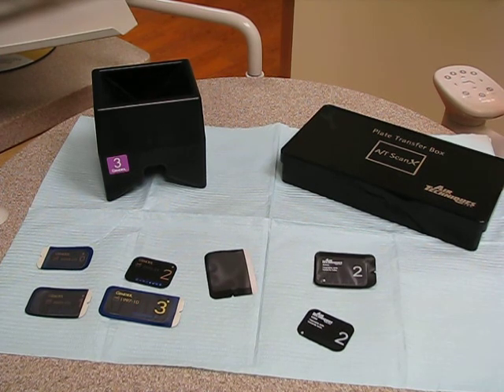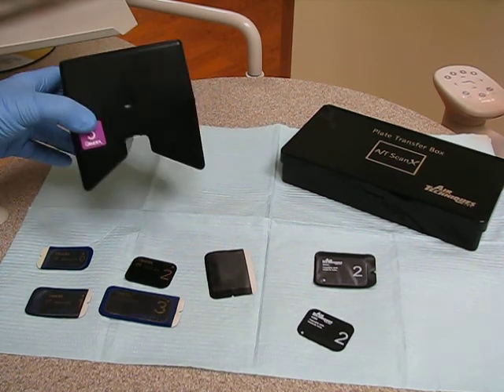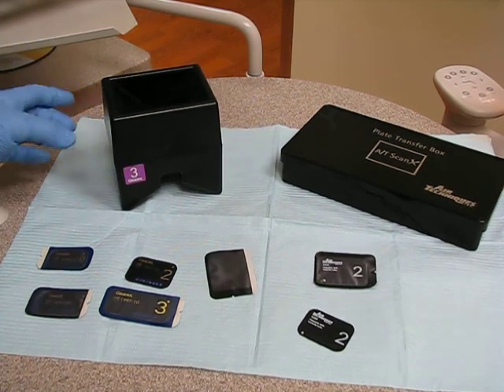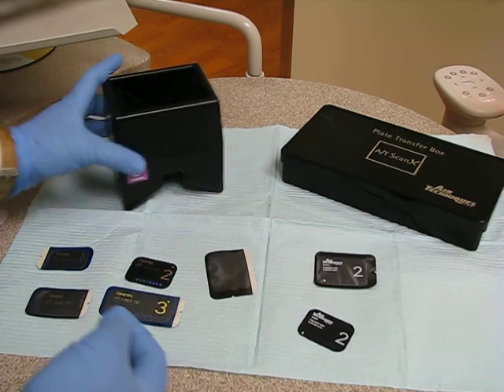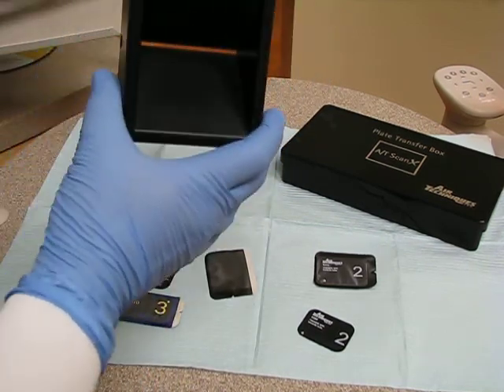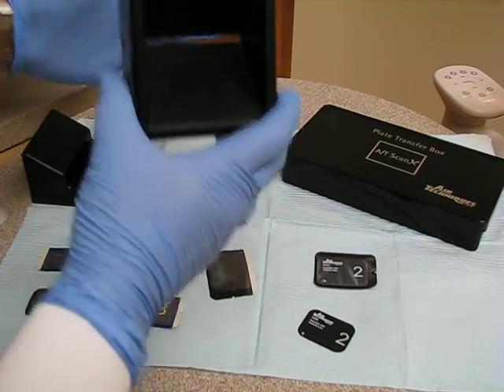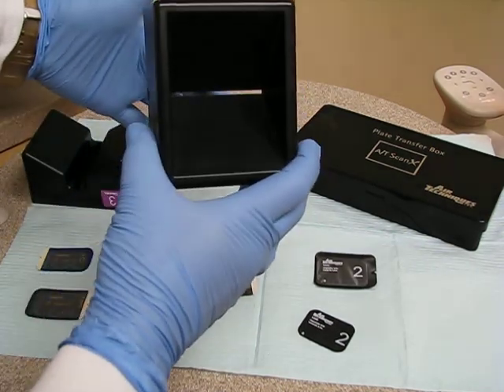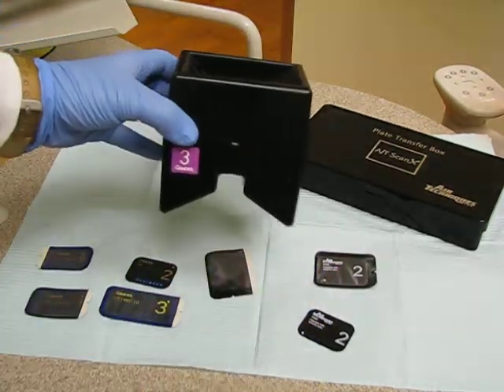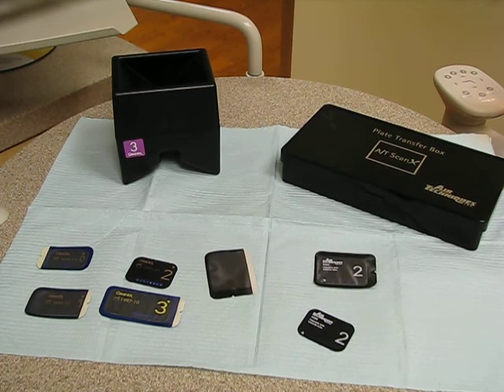Here we have a couple of things I'm going to show you what they are and how we use them. This black box would be equivalent to your LED box. Once you take your image, you open it up and drop it in — there's a little slit in here. It falls into this black box. In dental materials and radiology, anything that comes in a dark bottle or container is because it's light sensitive.